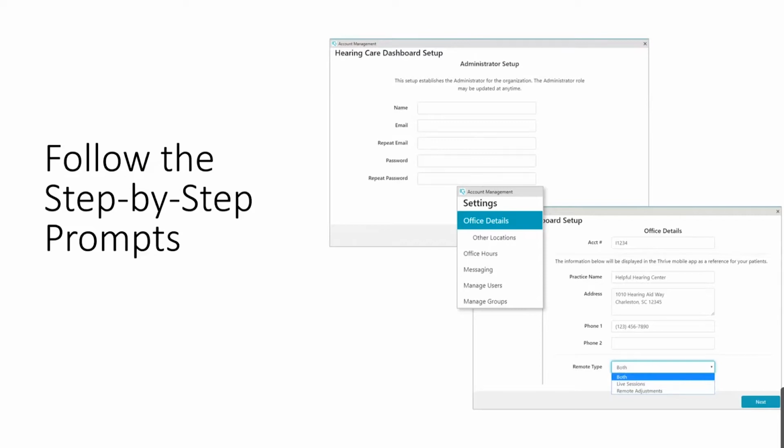Now, if you'd like more information on how to set up your Hearing Care dashboard, we invite you to view our Starkey at a Glance video of the Hearing Care dashboard setup process.